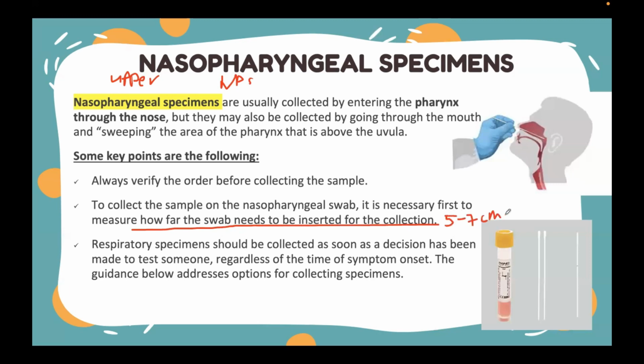So ma'am, ano po yung indication na na-collect na po siya or tama yung depth, yung lalim no, na ipasok namin na swab? Usually may indicator yan dito. May hati yan dito. So yun yung kanyang correct depth. Kasi pag masyadong mababaw, hindi mo na target, hindi mo nakuha yung talagang virus if ever na present, or pag masyadong malalim naman, baka masaktan naman si patient. Too much invasive na siya.